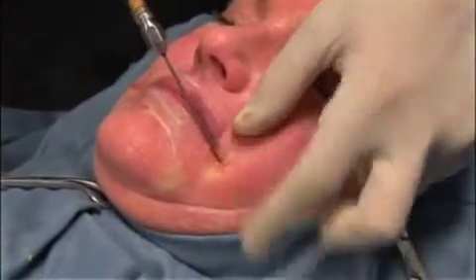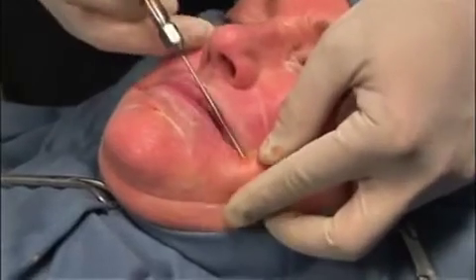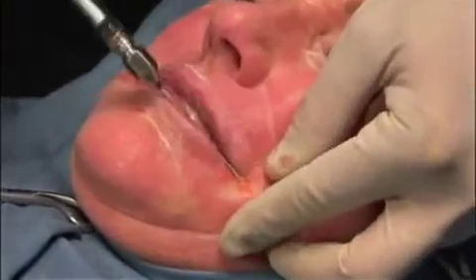It can be observed here that with facial nerve blocks and field blocks, the patient is very comfortable during the fat grafting process. Here, the mesolabial fold is being injected.